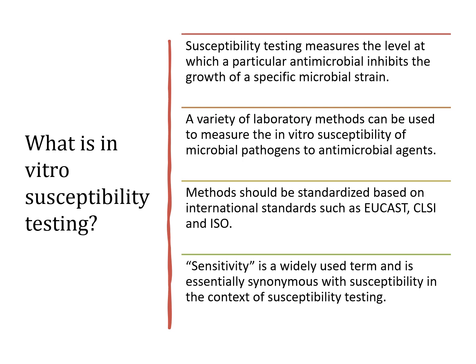A variety of laboratory methods can be used to measure the in vitro susceptibility of microbial pathogens to antimicrobial agents. Methods should be standardized based on international standards such as EUCAST, CLSI, and ISO. Sensitivity is a widely used term and is essentially synonymous with susceptibility in the context of susceptibility testing.